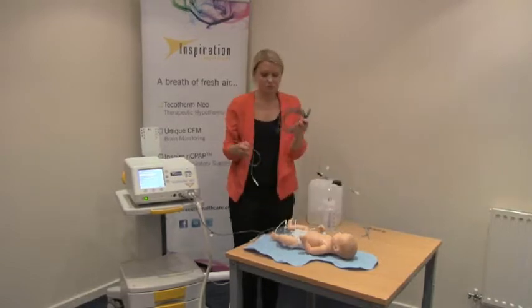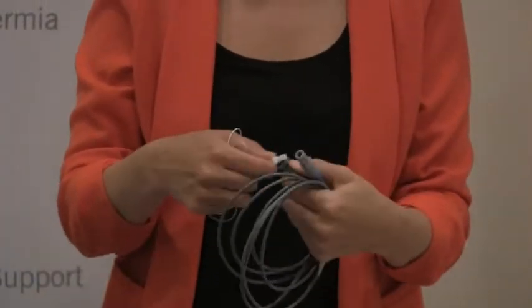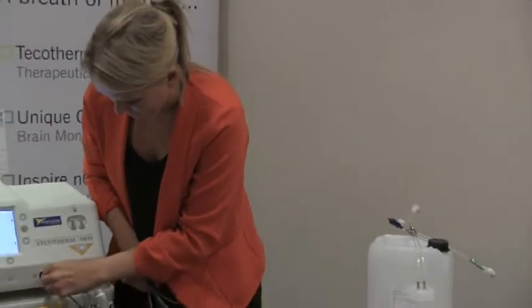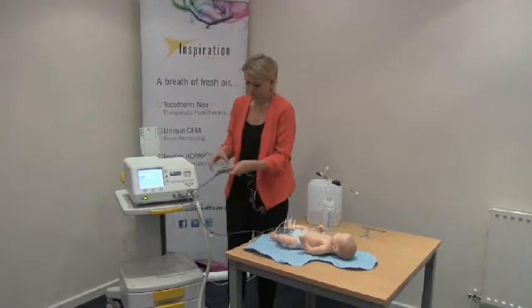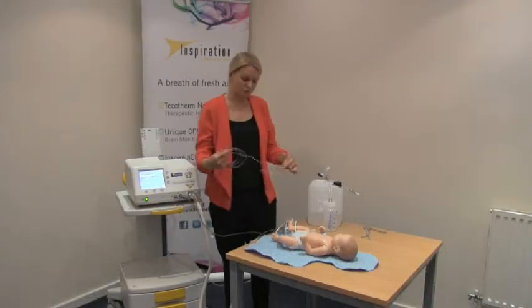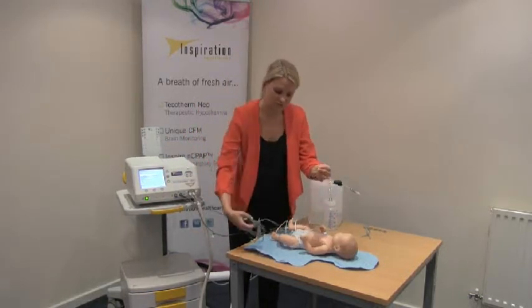For our skin probe, again we have a reusable adapter cable and a disposable probe. This has a different connector type to the rectal probe and will go into the system port for skin. The skin probe is not essential to the operation — it's the rectal temperature that feeds back to the servo controller. But if using it, we recommend it's placed outside of the mattress, either on the forehead or on the chest.